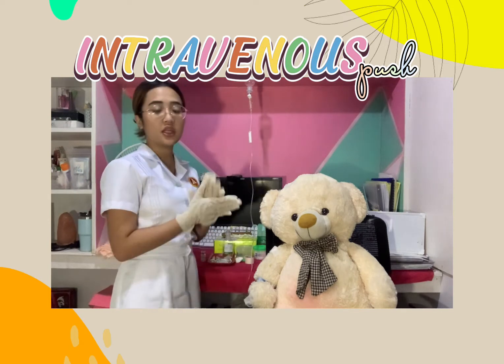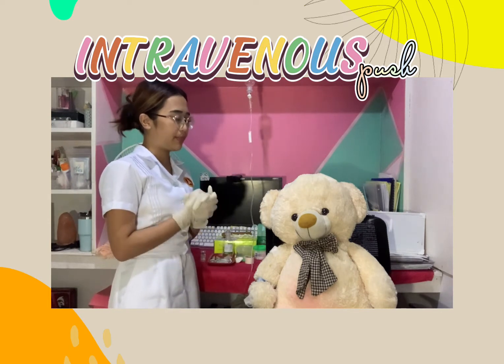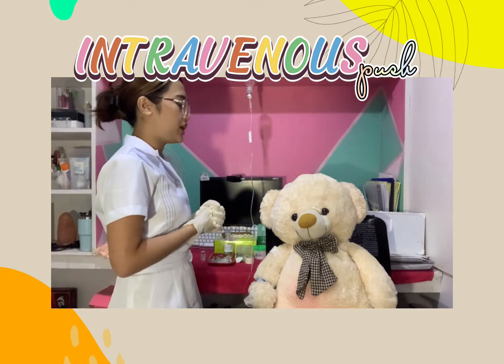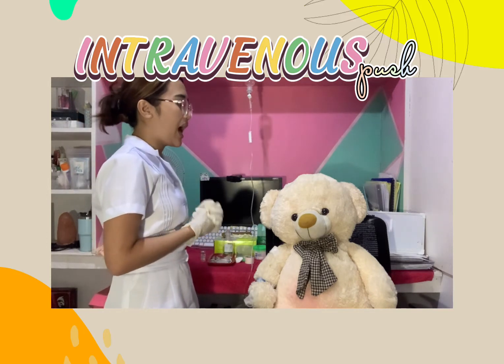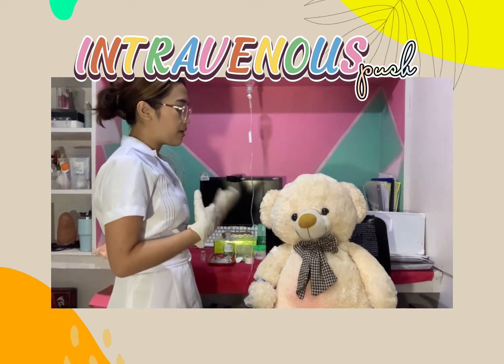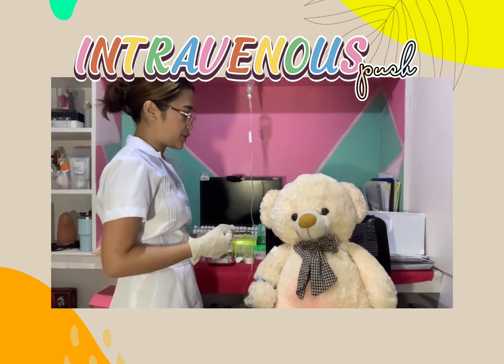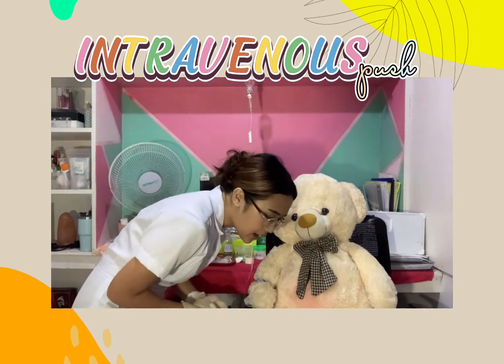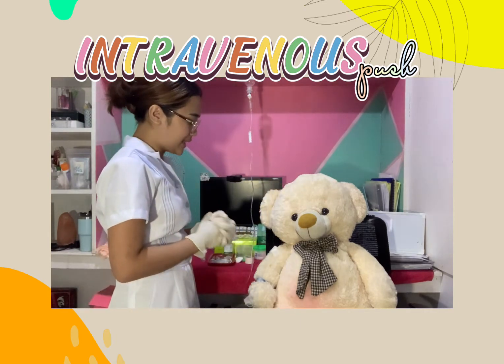Here we need to establish rapport with our patient. Good day ma'am, I am Career May Emisidra po, and I will be your nurse for today. I will do the IV preparation for the IV push po. To verify your identity ma'am, may I ask for your name? Also ma'am, may I look at your wristlet?